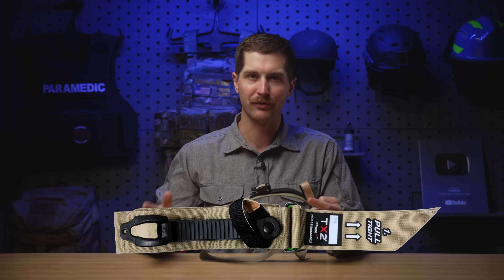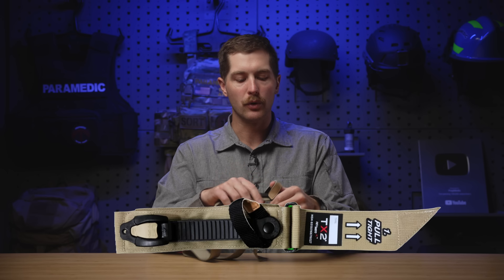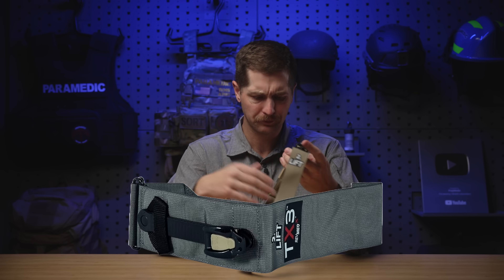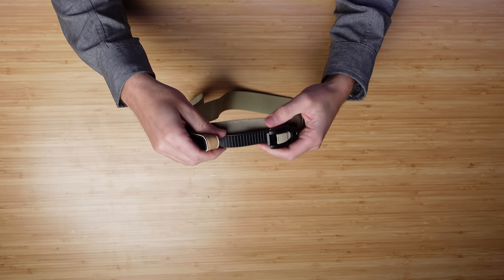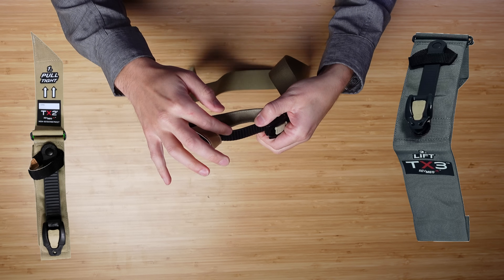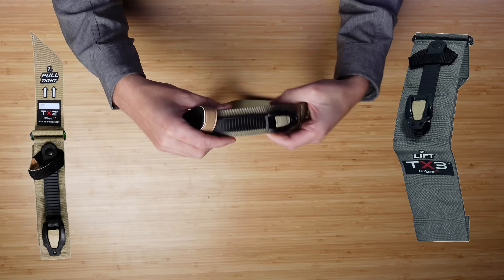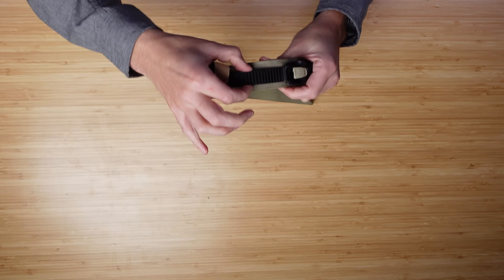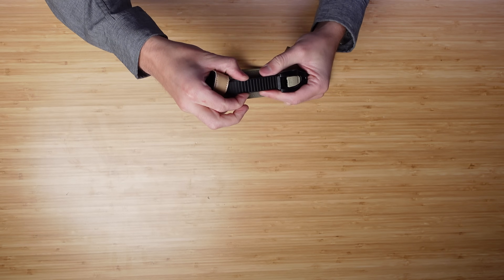If somebody knows the major difference, let me know. The buckle is pretty much the same. The TX2 is just nylon without this little leather veneer sewn to it, but it works the exact same way and is the same thickness. The TX3 is the same thing except it's got a three-inch band, which in theory lowers occlusion pressure, reduces some tissue damage, and decreases the pain when placed on a patient — which can be a big deal. With all three tourniquets, I believe the ratcheting mechanism is the exact same width, meaning you're getting pressure from this one-and-a-half-inch strap over most of your limb, but right at the buckle it's actually going to be 0.75 inches of pressure.